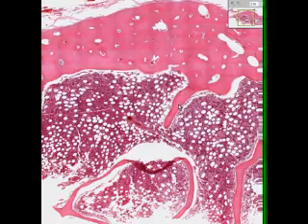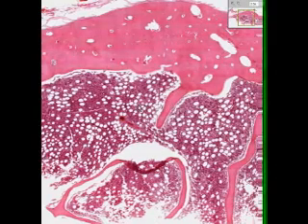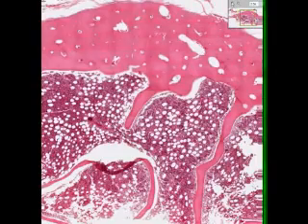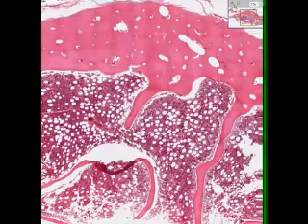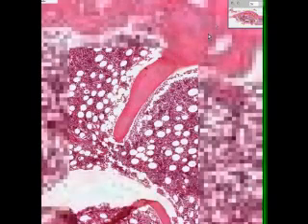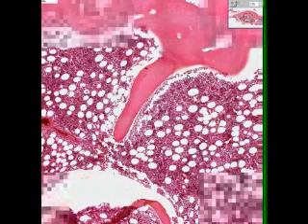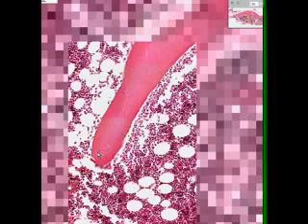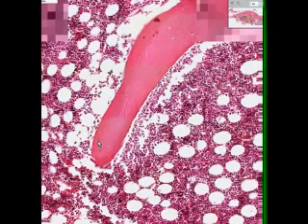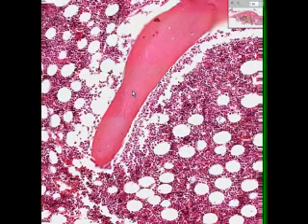Spicular bone is much simpler than cortical bone, or cancellous bone is much simpler than dense bone. Let's take a look at one of the spicules. In the spicule, you will not see Haversian canals or Volkmann's canals, but you will still see osteocytes. There's one, there's one, there's one, there's one, there's one.